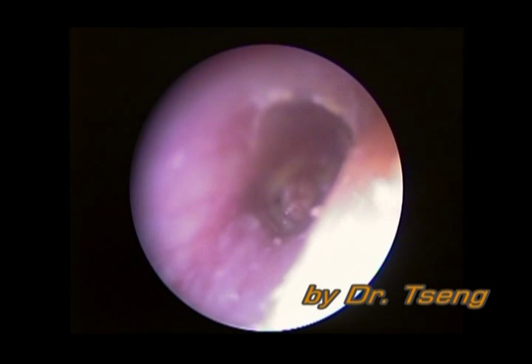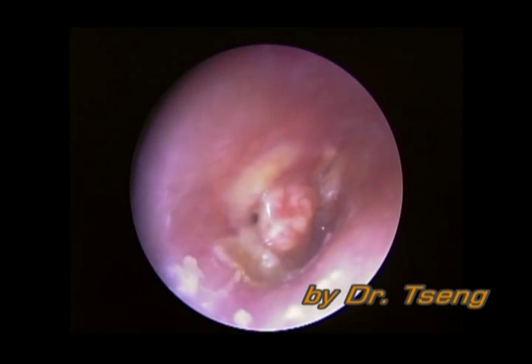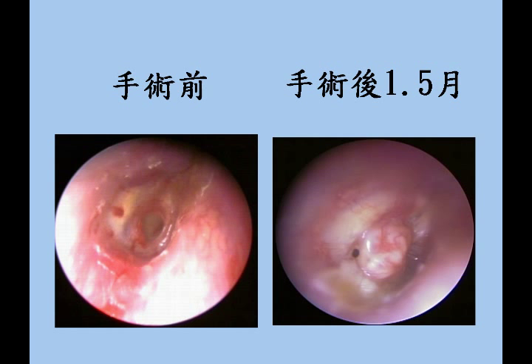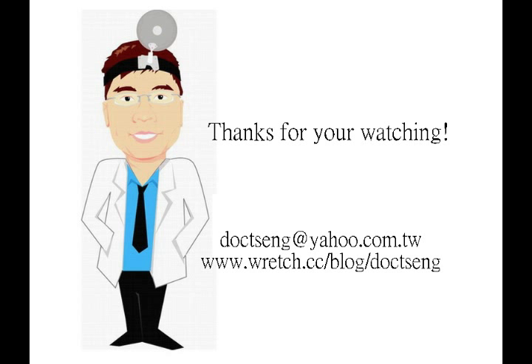From the post-op 1.5-month endoscopic view, we can see the cartilage flap clearly. We also noticed that blood vessels had grown into the flap. From the pre-op and post-op pure tone audiometry, we can see the air-bone gap was closed after surgery.